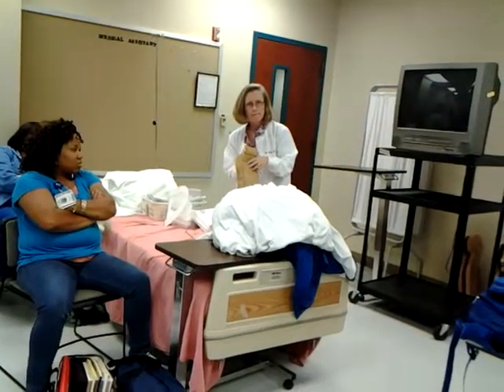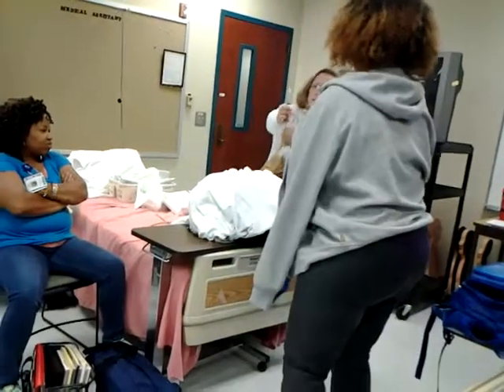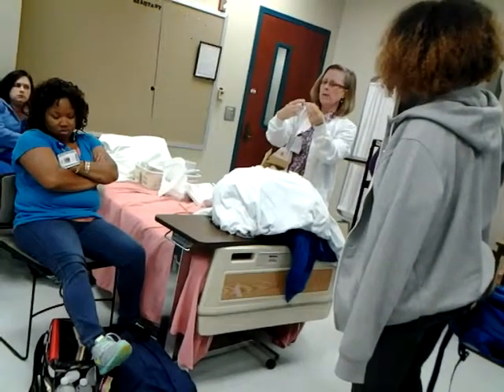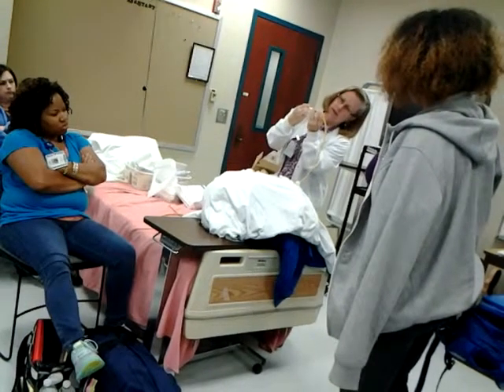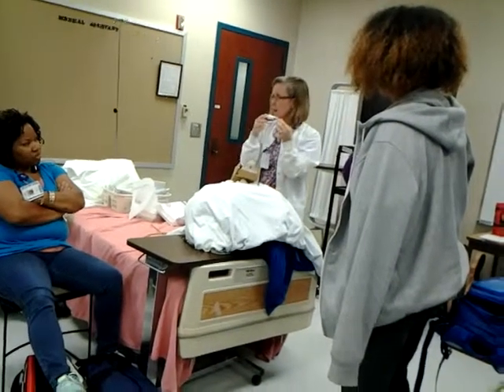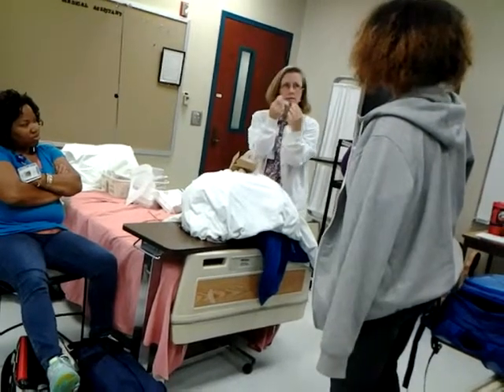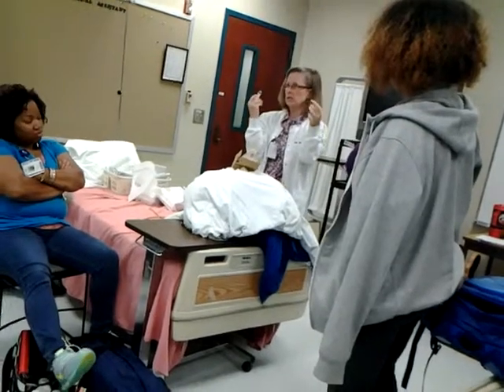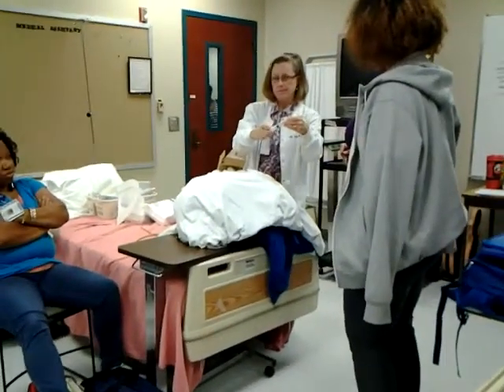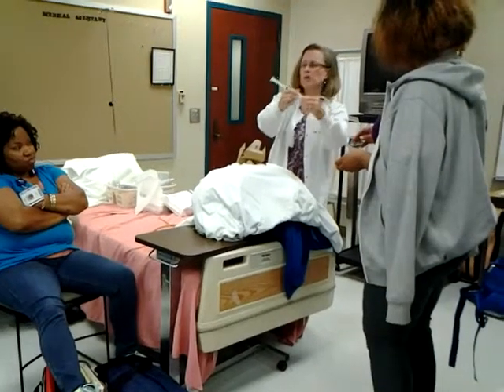When I inflate the balloon and let go with my thumb, it starts back-flushing — coming back out. So keep that in mind: before you detach the syringe, hold your thumb over it while you detach it, or you'll lose the water from the balloon.